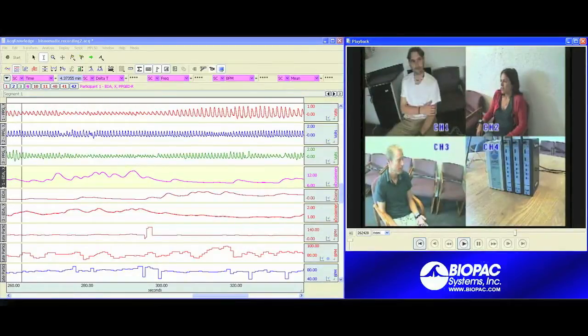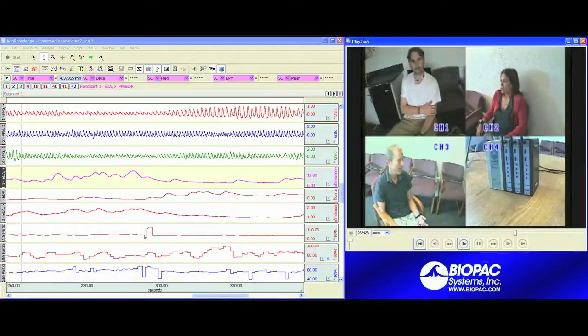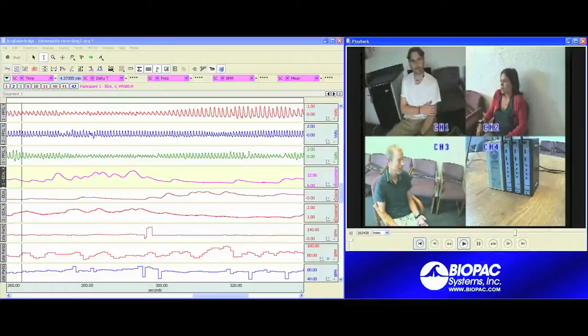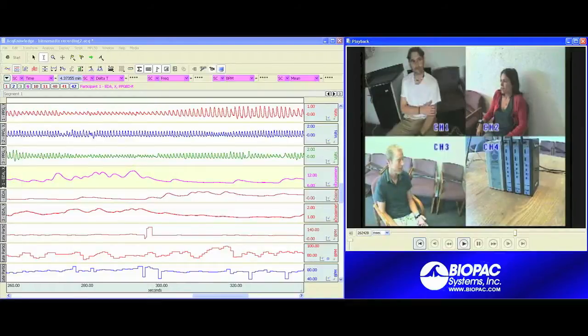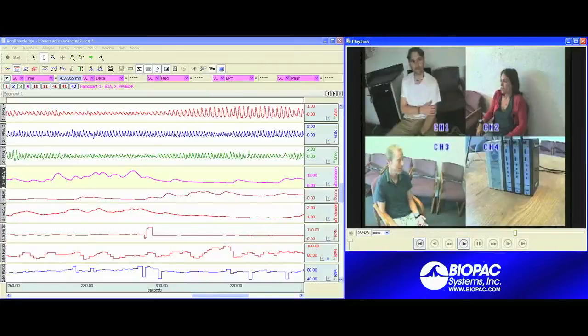As you can see, this link between the video data and the physiological data is a powerful research tool, one that can be applied over multiple disciplines including psychophysiology, exercise physiology, animal physiology, and sleep studies.